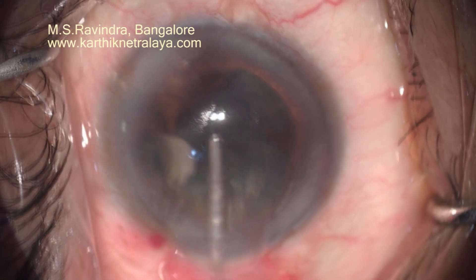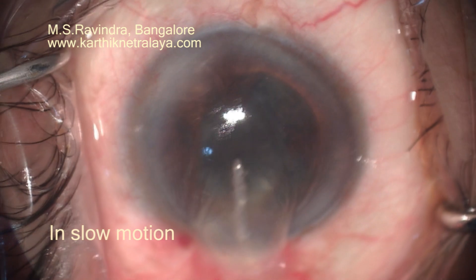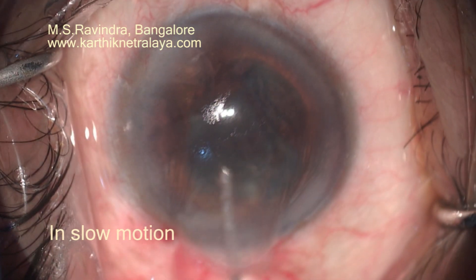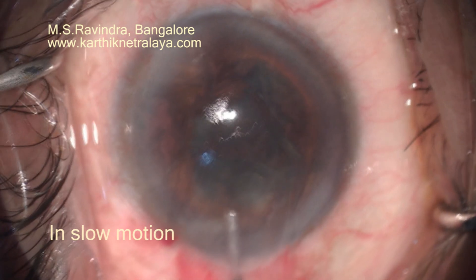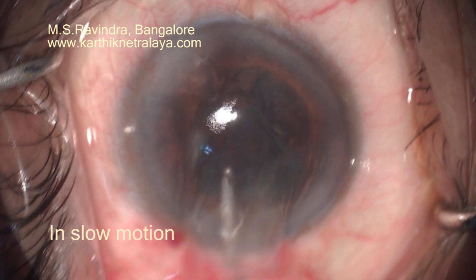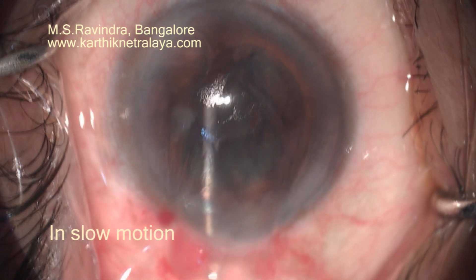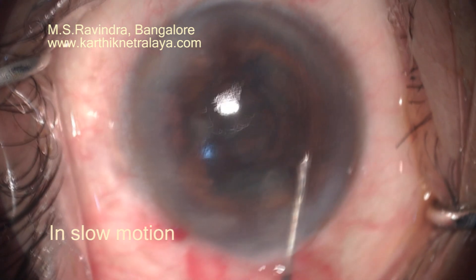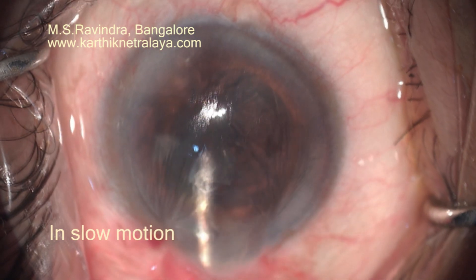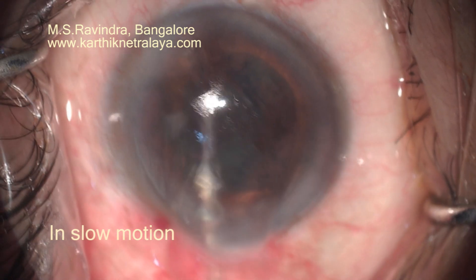The nucleus in the anterior chamber is protected by viscoelastic infusion, which separates the nucleus from the endothelium throughout. It is bisected into two pieces and the nucleus-epinucleus are removed. See the way the anterior chamber is drained of debris — the 23-gauge cannula is continuously injecting viscoelastic into the eye. The direction of the cannula is towards the center of the anterior chamber, and the plane is parallel to the cornea.